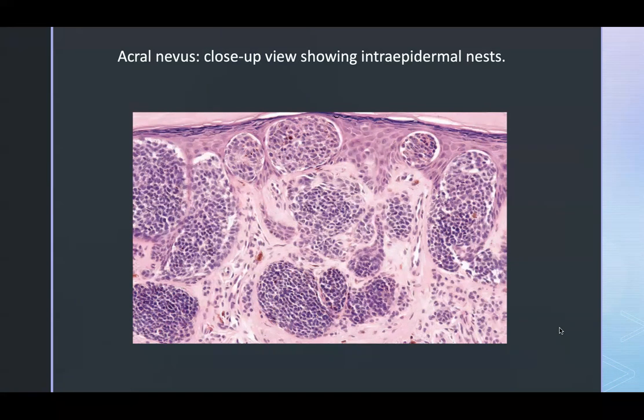It's not going to be diffuse dark like a melanoma. But I have had acral melanomas where some areas of the nest look very benign looking, but in the context, it was definitely a melanoma. And even those benign looking nests in the melanoma were heavily positive for PRAME, which is very interesting. So there's something about the molecular status of the melanocyte that is being revealed with certain new immunohistochemical stains.